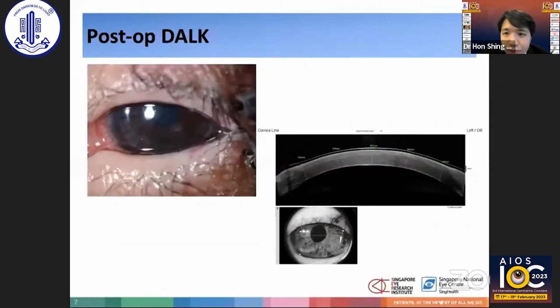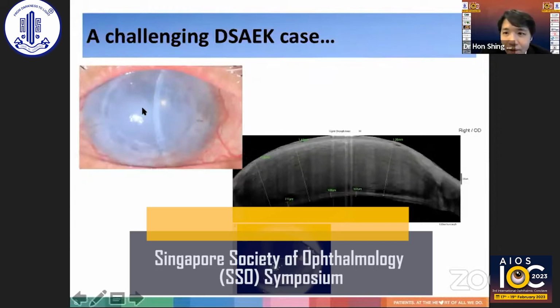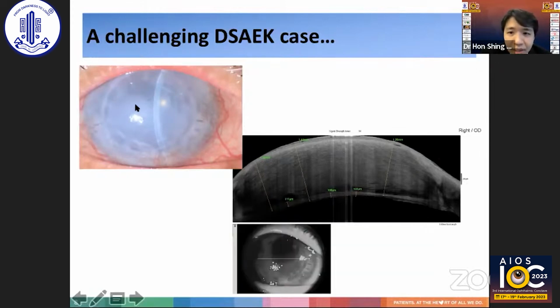This is post-operatively showing a clear corneal graft, and RTVue ASOCT shows full attachment of the Descemet's membrane despite the 2 microperforations. This is another patient with an almost opaque cornea, as you can see, due to severe bullous keratopathy. She had a previous penetrating keratoplasty followed by a DSEK under this PK, and she underwent multiple glaucoma surgeries.